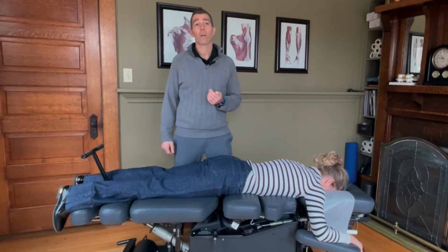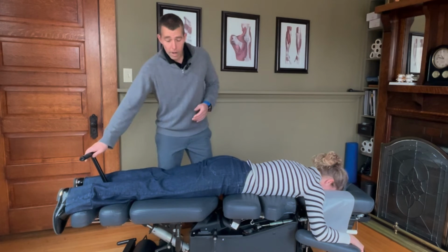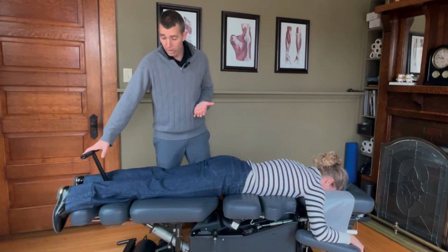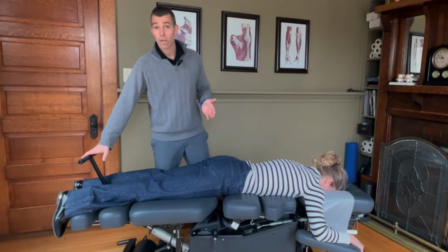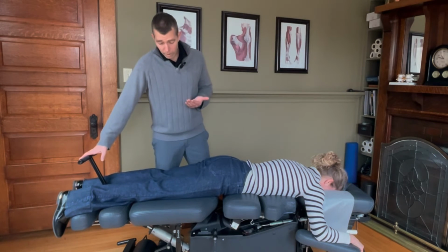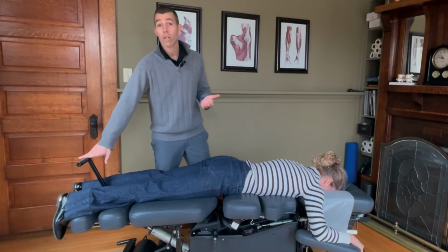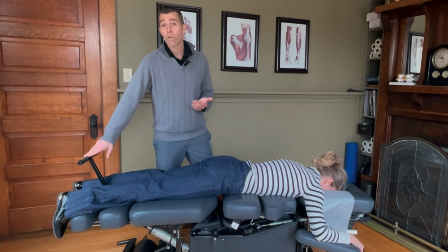So Cox Flexion-Distraction is performed using a specialized table that gently pulls and stretches the spine. So how it works is with the patient laying face down, the table can be unlocked, and then the bottom part of the table where the patient's legs are aligned is allowed to be moved up and down. And because of the connection between the legs into the hips, into the pelvis, into the spine, what we see is that motion of the legs will also translate into creating a gentle pulling or flexion motion of the spine itself. Now, this part is very similar to other traditional decompression tables, as we talked about earlier.